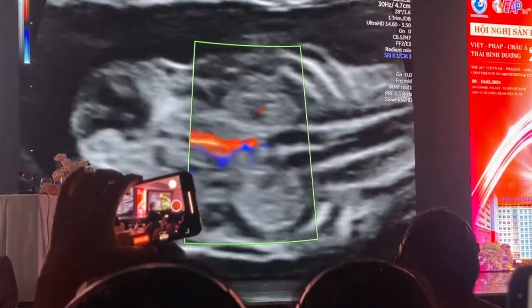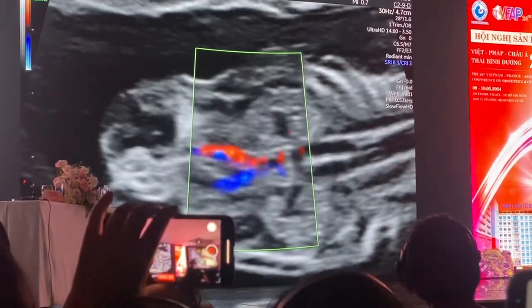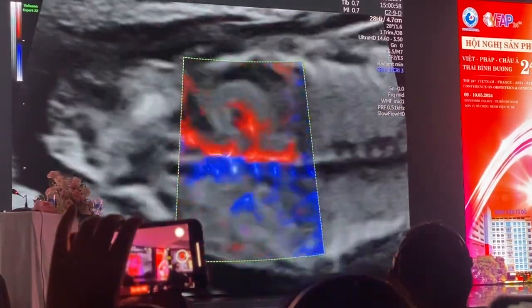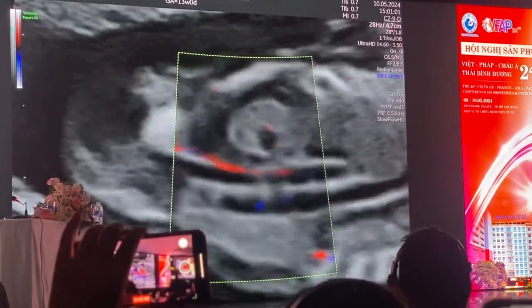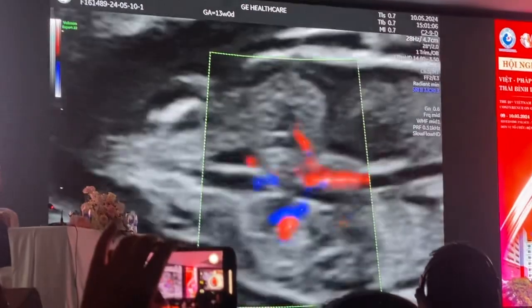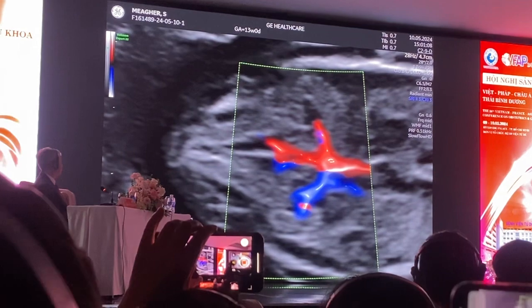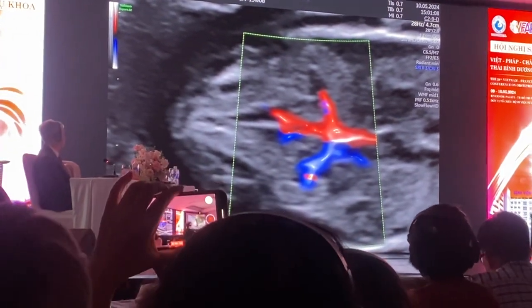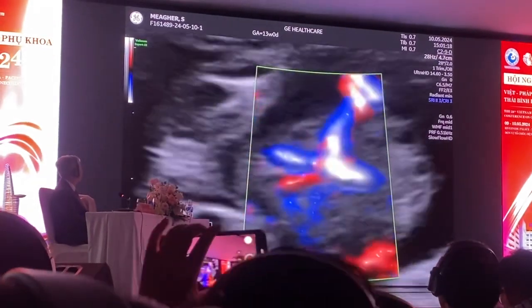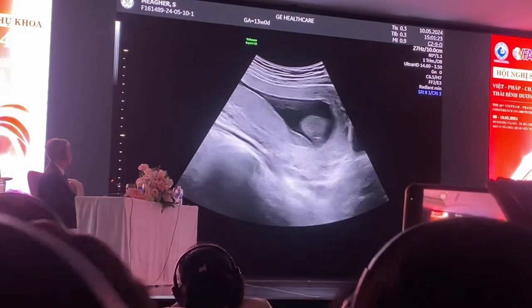When I go to slow flow, I like to go into a map, and I select a colour map of 4. And then you can see that the vessels are just much easier to see with slow flow. This is a general principle, and when I go back to examining the heart, I'll be showing you as well. But you can see you've got both renal arteries coming in, and the length that it demonstrates in slow flow is different to what you saw with power. It's just that added sensitivity that slow flow brings, and it can be very helpful, particularly if the patient is of large BMI and you're struggling to see the anatomy.